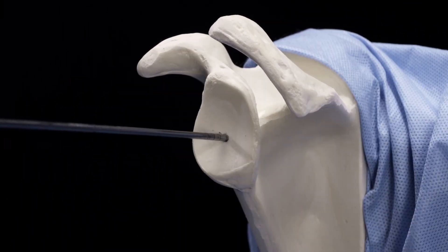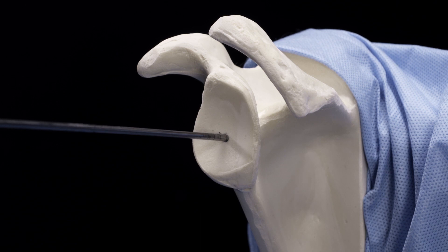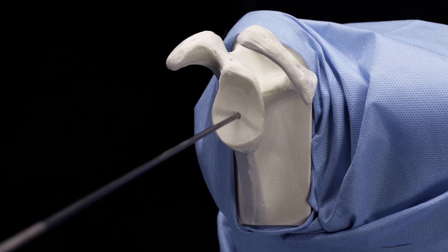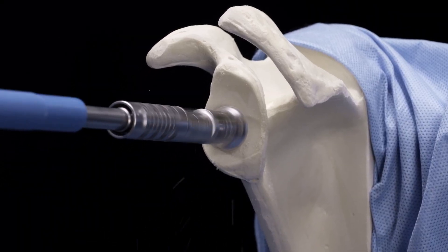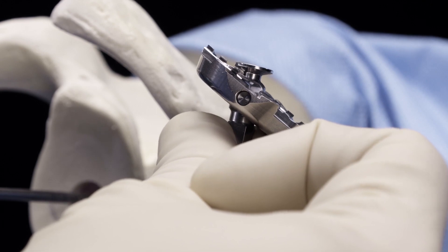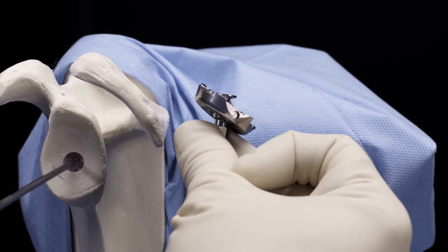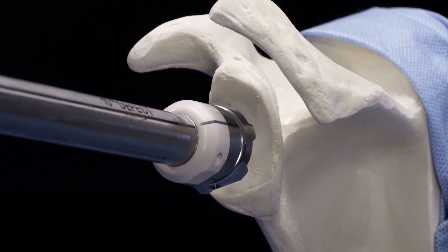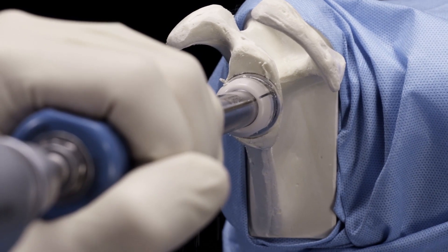I'd now like to highlight the one key difference between using the VIP reaming system for a standard MGS and an augmented MGS. We're using a sawbones to demonstrate this. We've already placed our central pin and we'll use the same VIP pilot reamer to do our pilot ream. Here is the secondary VIP reamer for the augmented MGS. You'll note it has the elevated nose to provide a positive stop when it enters into the pilot hole, and again this has a nice positive stop when you've completed your reaming.